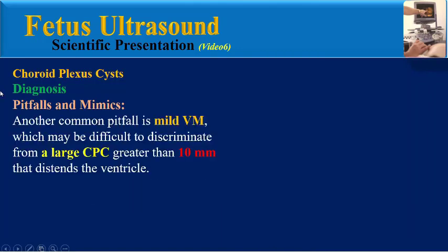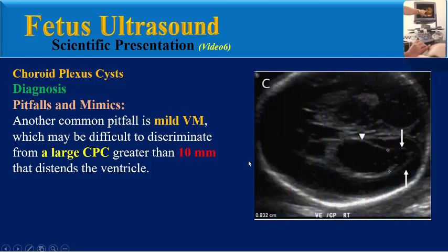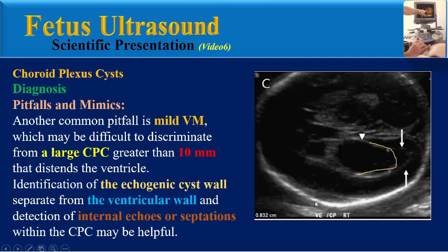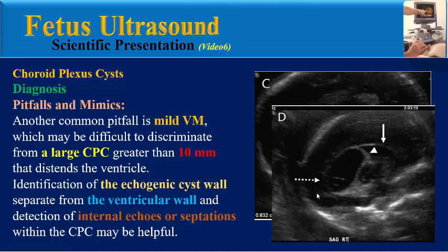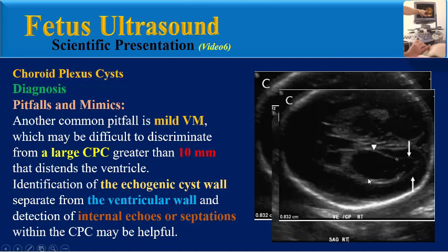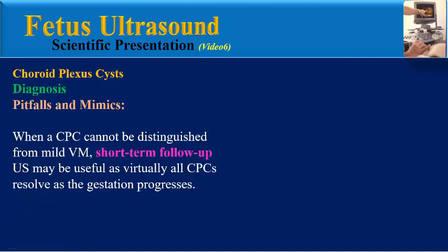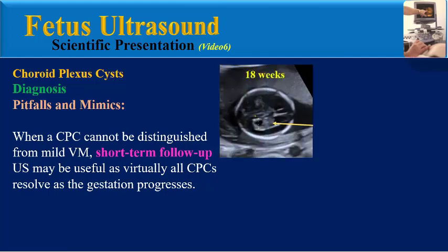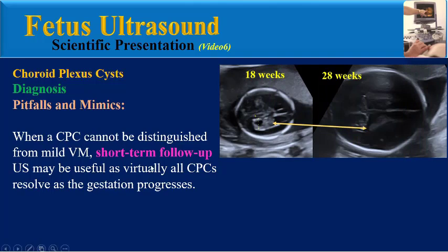Another common pitfall is mild ventriculomegaly, which may be difficult to discriminate from a large cyst greater than 10 mm that distends the ventricle. Identification of the echogenic cyst wall separate from the ventricular wall and detection of internal echoes or septation within the cyst may be helpful. The cyst may cause mass effect on the ventricle wall, but the measurement of the lateral ventricle is within normal range. When a cyst cannot be distinguished from mild ventriculomegaly, short-term follow-up ultrasound may be useful as virtually all cysts resolve as gestation progresses.